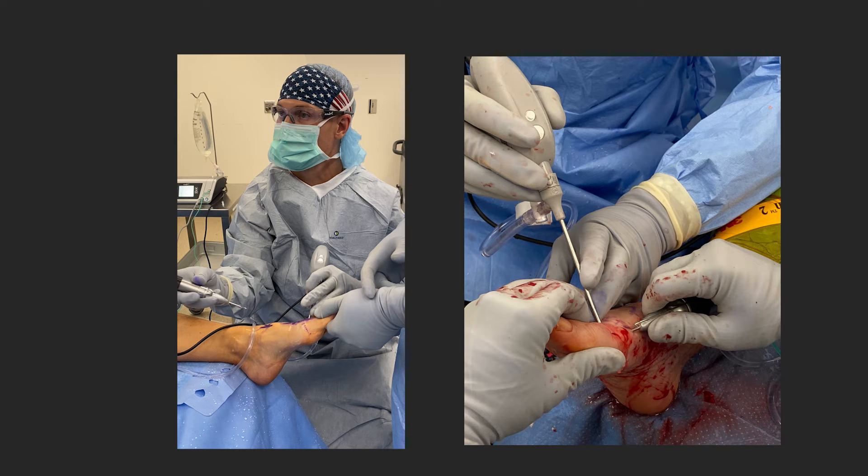At this point I've reduced and released my traction to allow me to manipulate the toe for different positioning. Now the MIS burr is going. The advantage of using Nano is not only visualization — it also irrigates, cools, and ensures all bone debris is removed from the joint. I can really taper my osteotomy here. The burr is barely touching the tissue, not driving it, and Nano's small maneuverability allows me to look and carefully take down the joint.